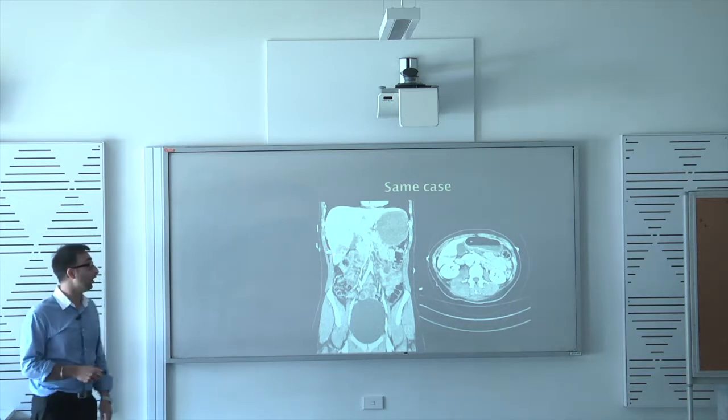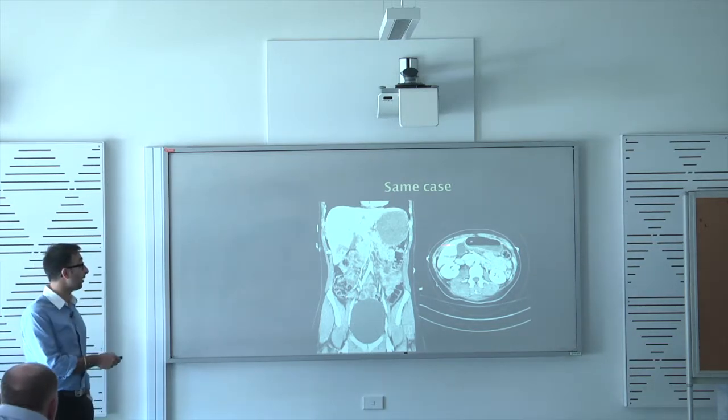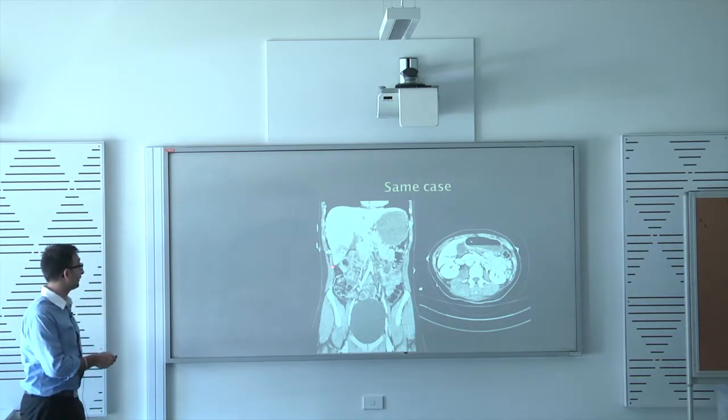So what this CT shows is that, unfortunately it's a bit bright, but there's a liver laceration involving the liver. It's characterized with a linear hypodense area through here, and there's probably a bit of hematoma. The pancreas looks normal, and you'd worry about that in a Chance fracture. But they've got locules of gas here, you can see.